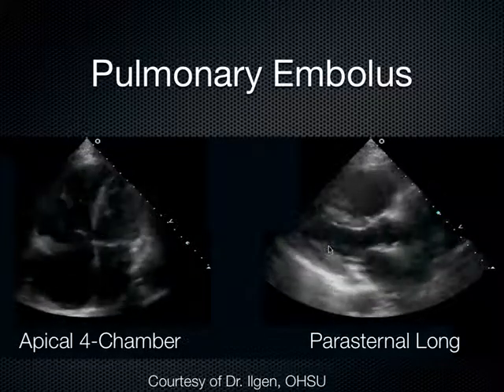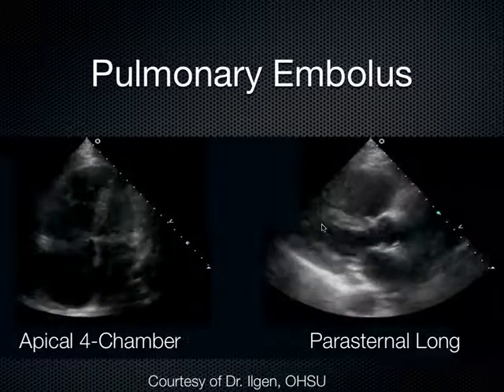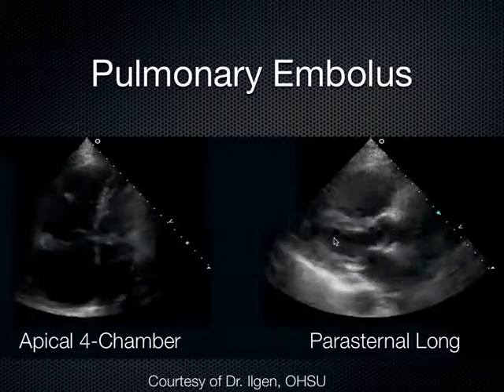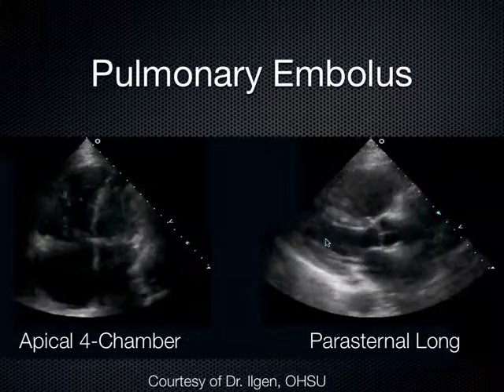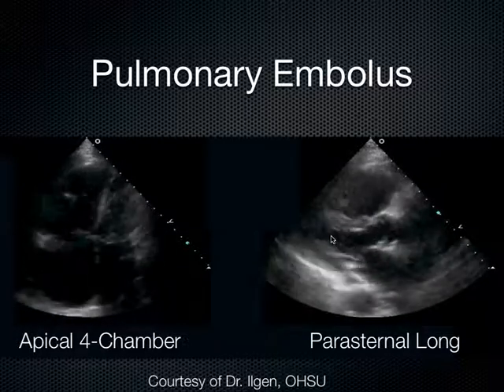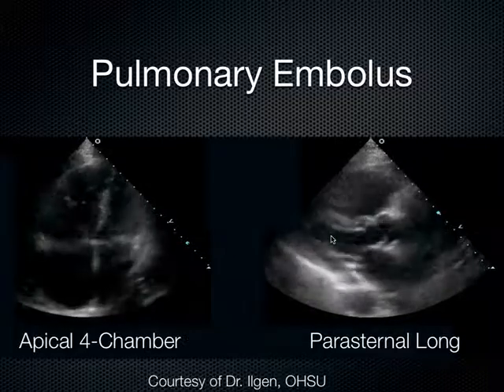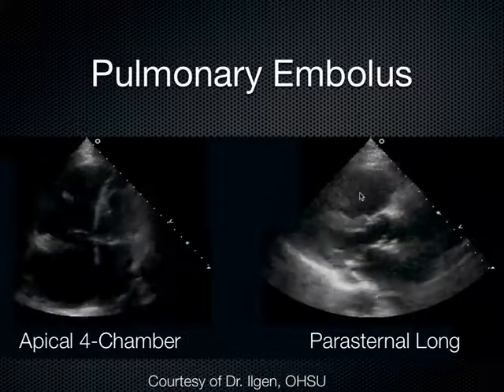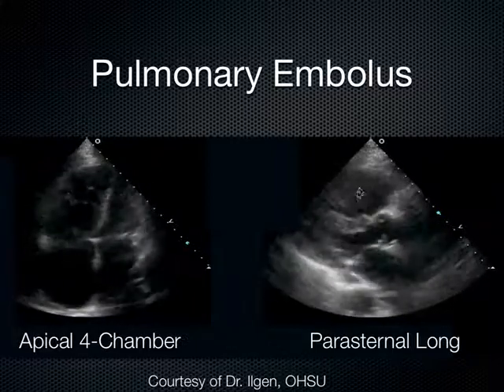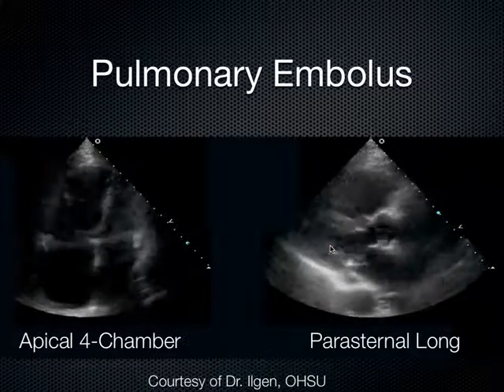In the parasternal long, same patient, the LV, what we see here are kissing papillaries. The inside of the left ventricle actually comes together and makes contact. The posterior wall makes contact with the intraventricular septum. That's an empty LV. That's a hyperdynamic heart with an empty LV. That tells you that the fluid's not getting there through the lung vasculature because it's all getting stuck. The RV is trying to pump against a pulmonary embolism. The RV is very dilated here, but it can't get the blood over to the LV.